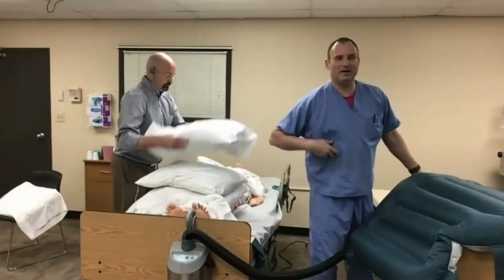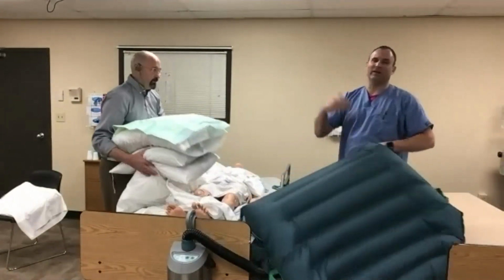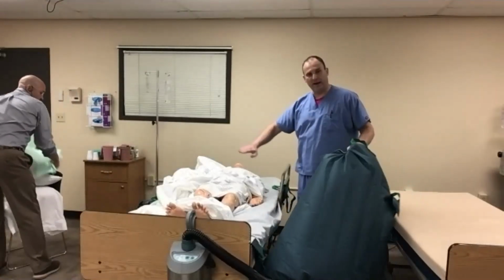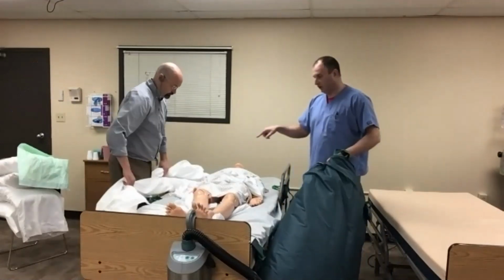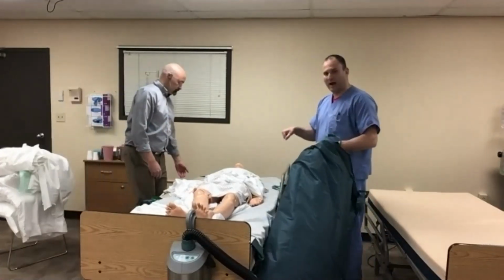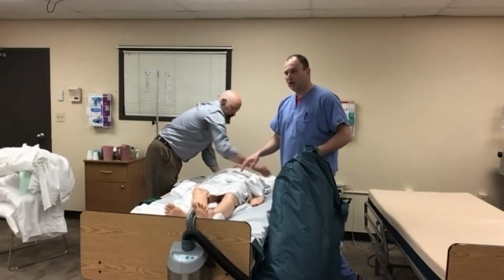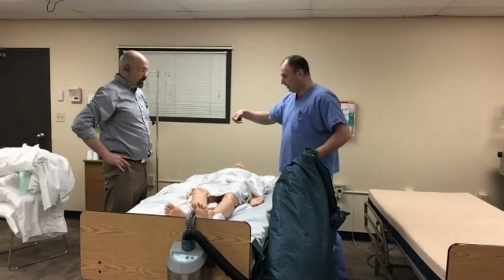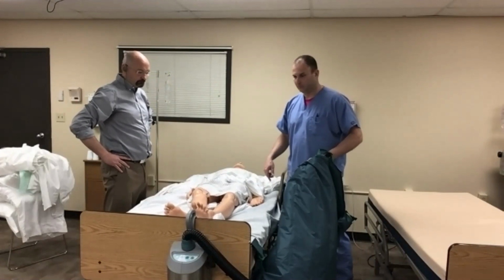Obviously, as I'm the one that has to turn that off, you could see the back going a little crazy. Once I would hold that there would be somebody to turn that off. One thing to note, we came laterally, we came up, and then we came over. The last little piece to make sure the patient gets centered was as I pulled it out, Chris gave another little push back laterally toward me to get the patient centered. So it's not just lateral up and over, lateral up, over, and then a little slide this way as you position the patient, okay?